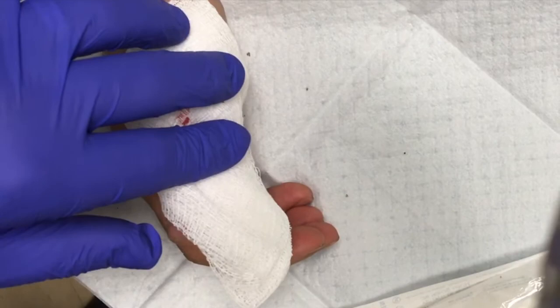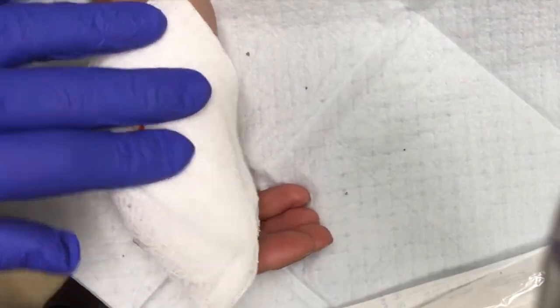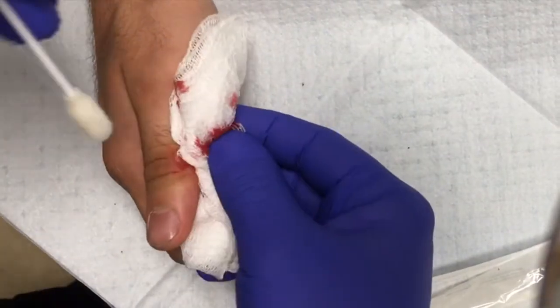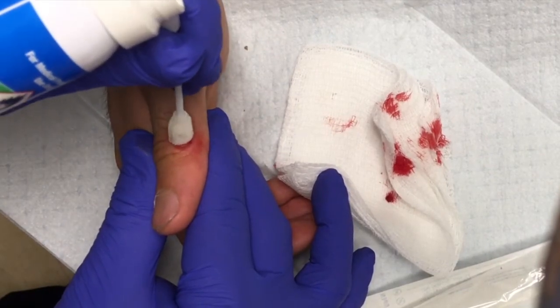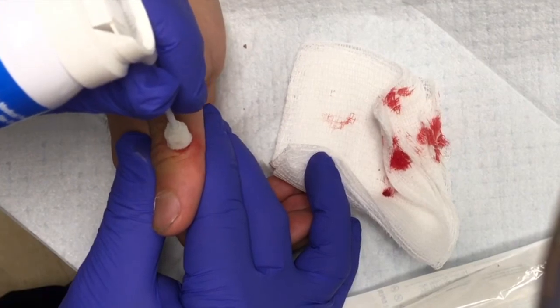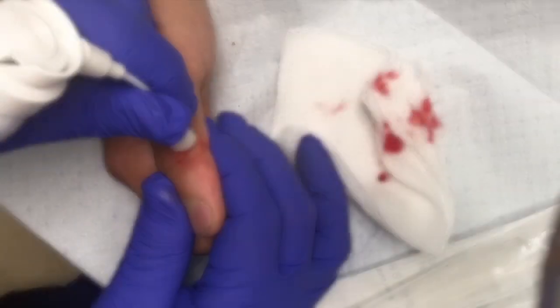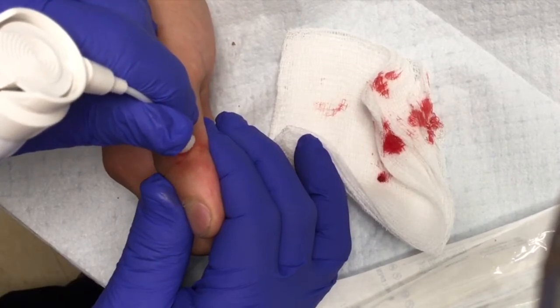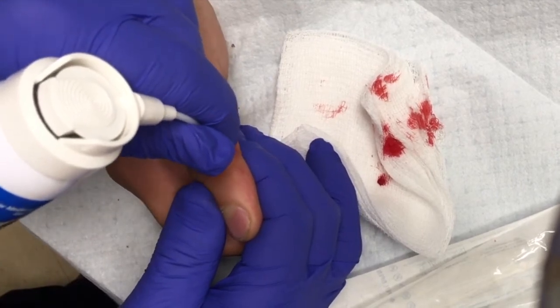We're going to use a product called Histo-Freeze. We need to see if we can freeze the area and see if this makes a little halo. Any pain? No — doing well.